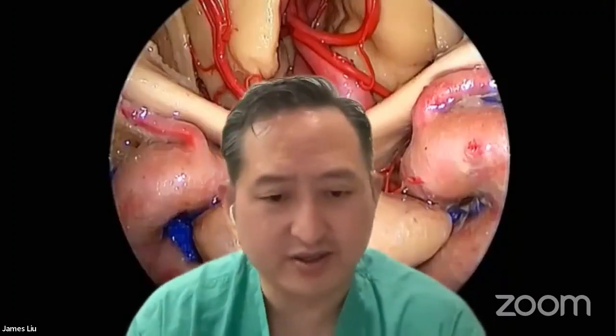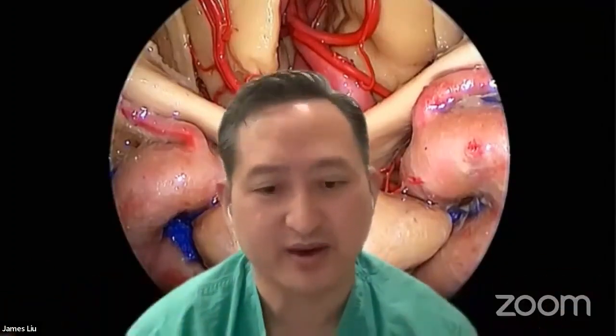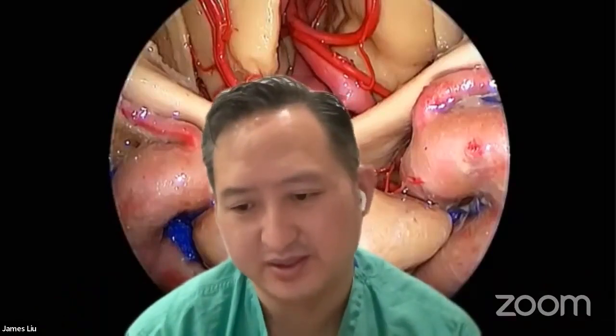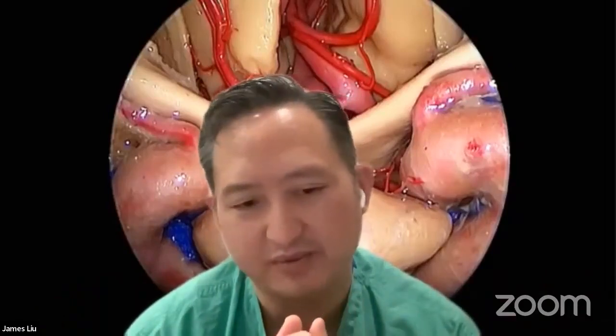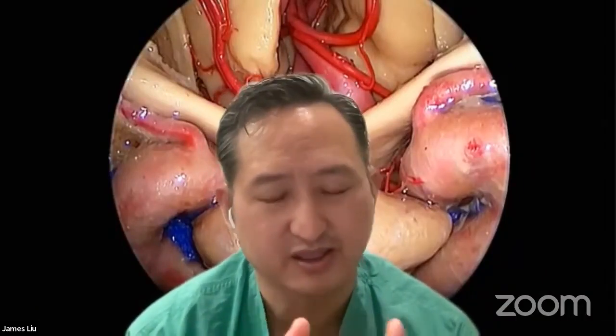So doing the extended approach is one thing, and reconstruction is another challenge afterwards, because now you've changed your extra-arachnoid surgery into a subarachnoid surgery. You need to be able to successfully repair the defect and prevent a post-op CSF leak. So that can be challenging as well.